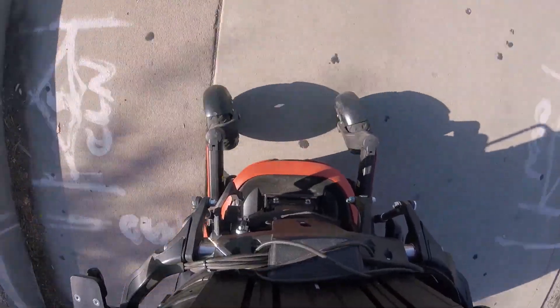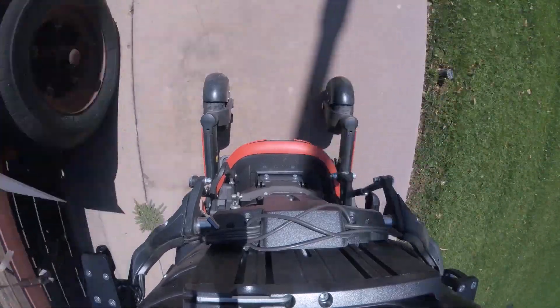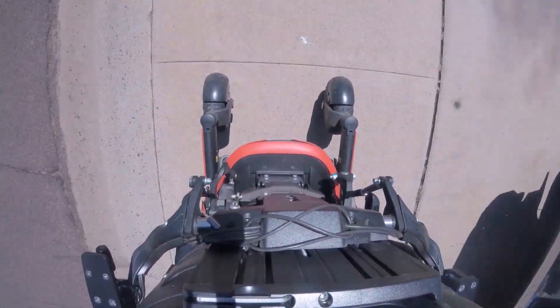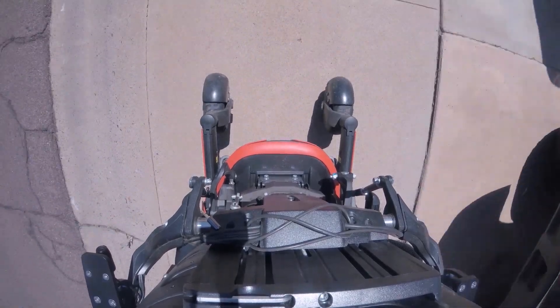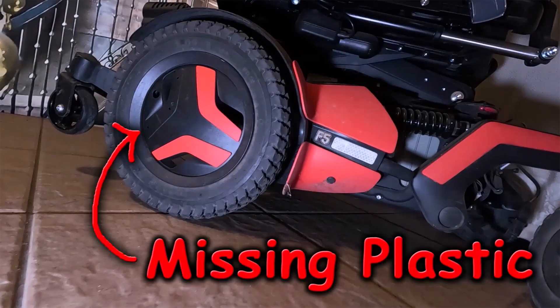Caster flutter is rare on most power chairs, but it was constant with my new chair. Nine months ago I started investigating caster flutter. The video took a long time to make because I couldn't solve the problem. There were a few times where the flutter was really bad — it knocked the back cover off the chair several times and knocked one piece of plastic off the wheel. I saw it fly off into the street but I couldn't get it back.